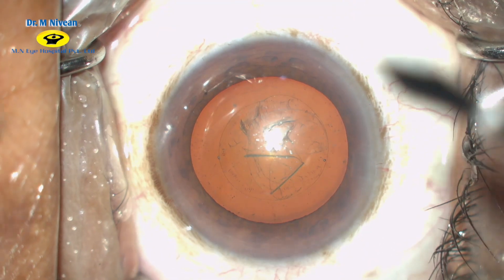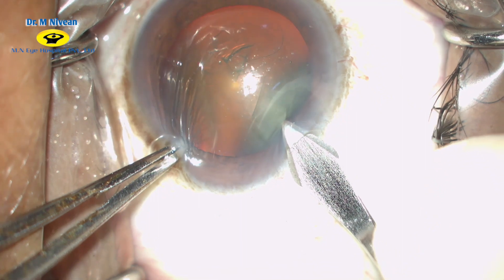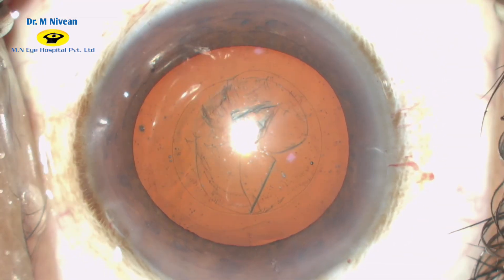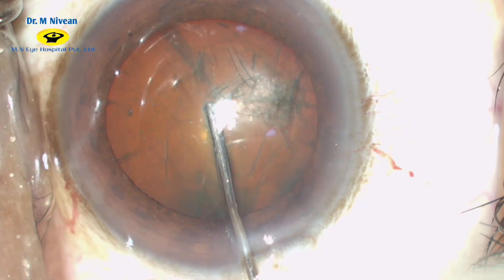A 2.8 mm keratome is then used to obtain a biplanar, square-shaped corneal incision. A hydrocannula then injects fluid underneath the anterior lens capsule, and you can observe the fluid wave passing through the center of the nucleus.